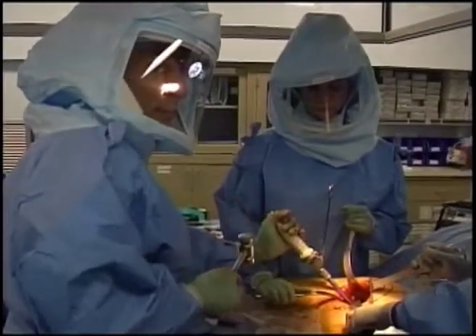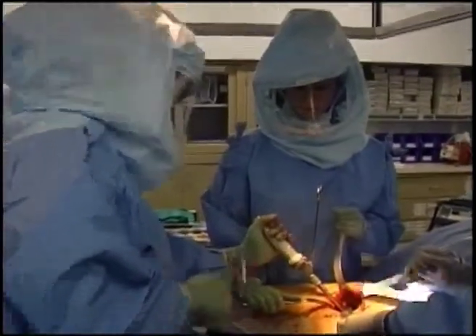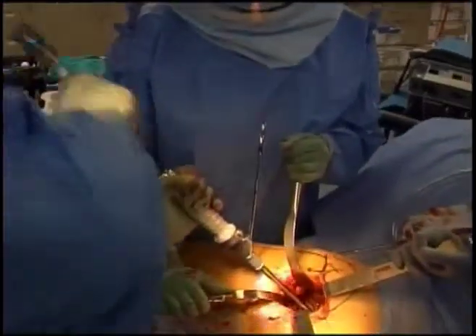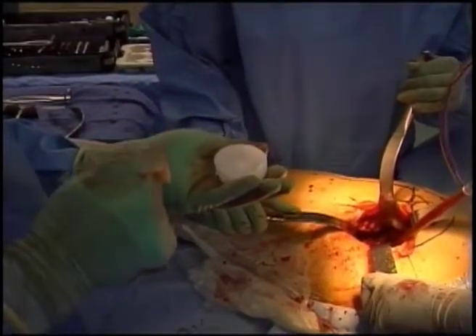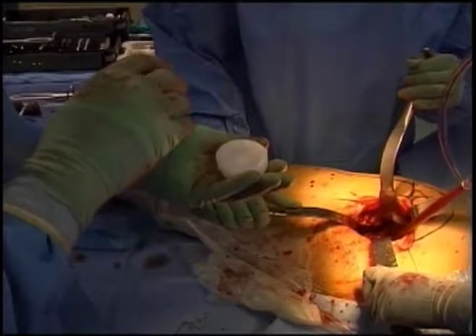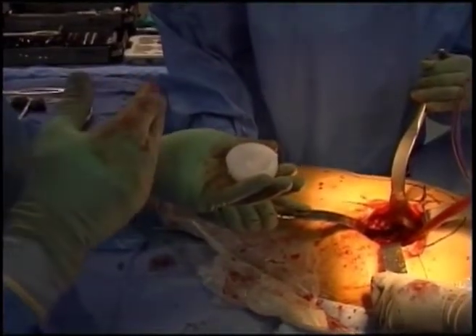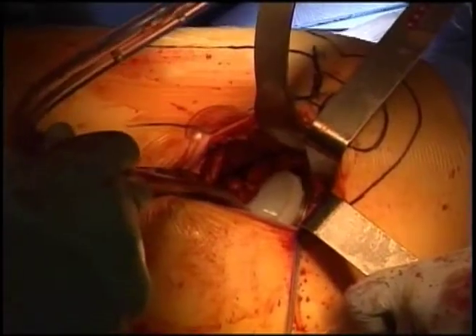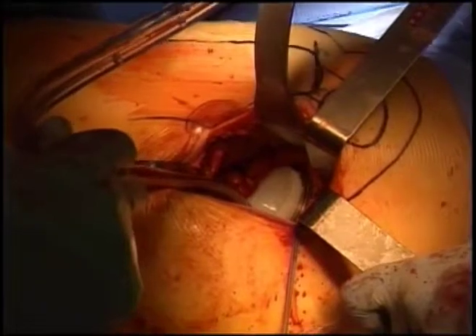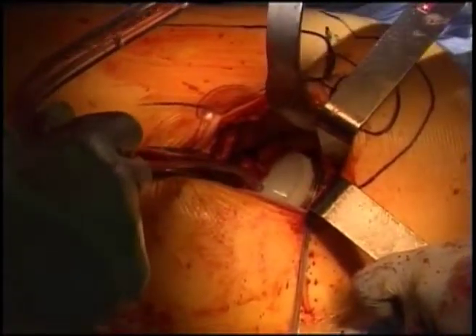Once the cup is positioned appropriately, it's impacted into place in the patient's bone. This is the plastic liner that inserts into that metal shell. It is on this plastic liner that the ball of the new hip replacement will glide to provide motion and pain relief for the patient. This is a look at the final shell and polyethylene or plastic liner in place, ready to accept the hip replacement.